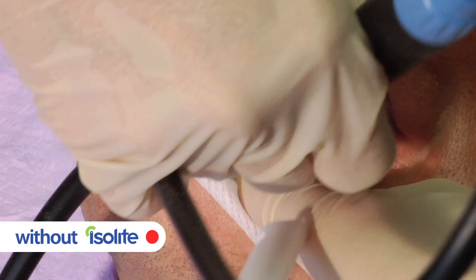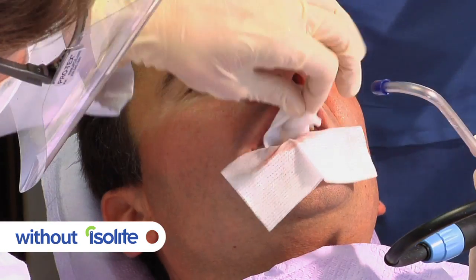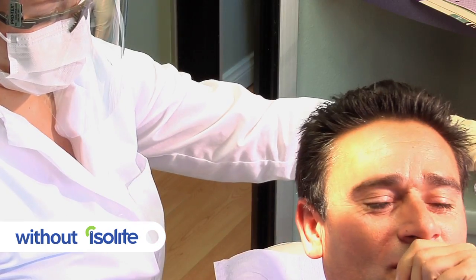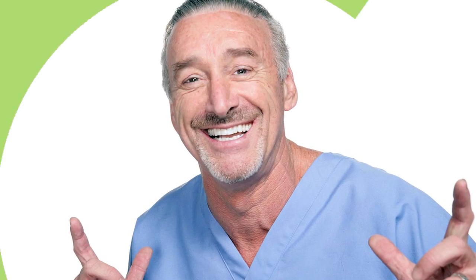Patients need to be repositioned for better access or visibility. Overhead lights need to be adjusted. Moisture builds up from the breath. And saliva continuously soaks cotton rolls, which need to be changed, adding time to each procedure.